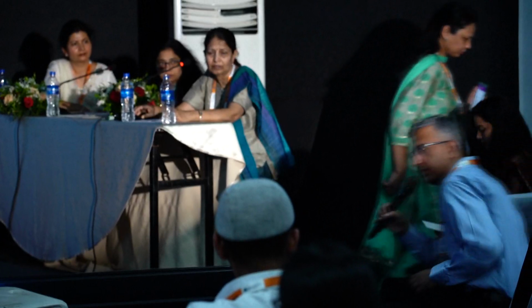Assessing a myopic disc is difficult not only for beginners, it's difficult for glaucoma surgeons also. And I think what's really important is to follow the rules that Madam has just said. So if you manage to isolate where the rim is, and then after that you look at the edge, making a careful documentation of that disc is really important.